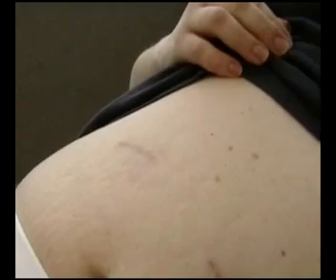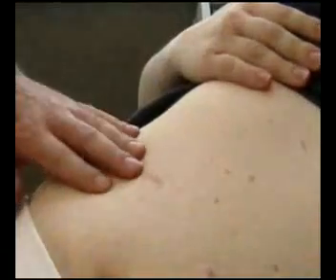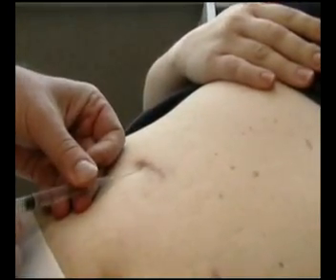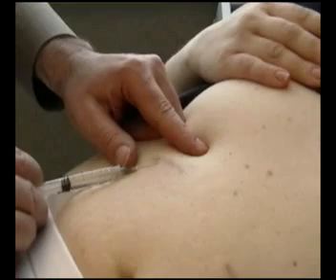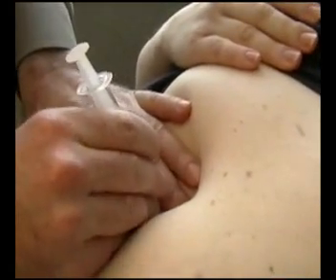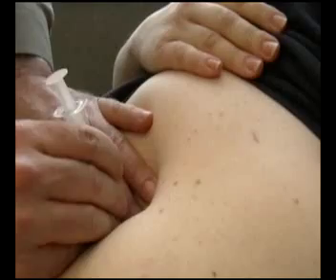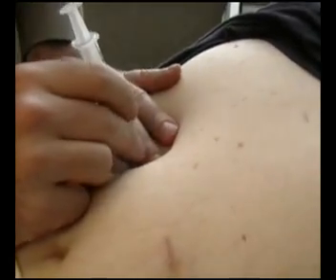Here, and feel for your port. Yours is really pretty easy to feel, which is nice. It's nice and flat. Okay, first thing will be the local anesthetic. And I know some people don't do this, but I think it makes a big difference in terms of your comfort. Okay, now bring your right arm up a little bit and kind of start to do that little bit of a crunch, kind of like start to sit up a little bit. Good.